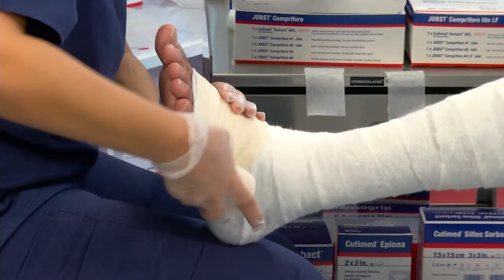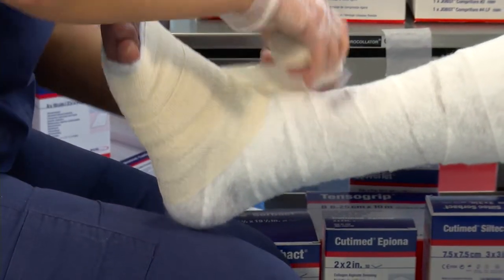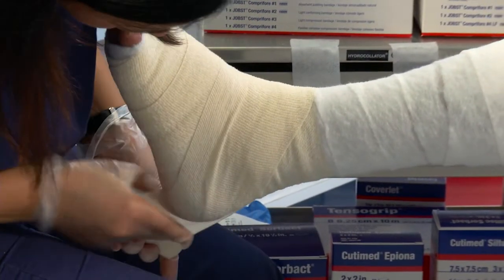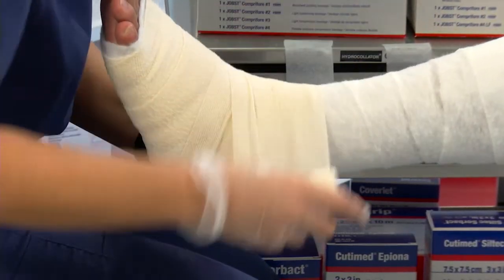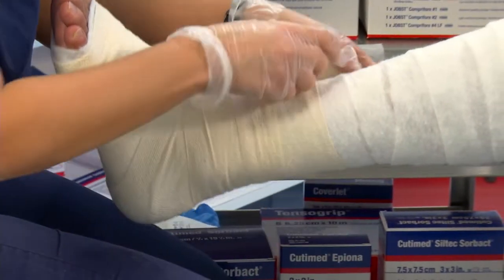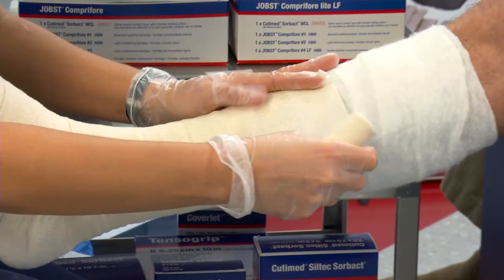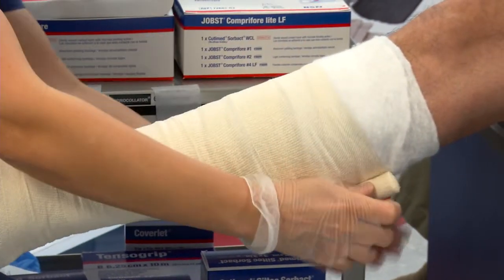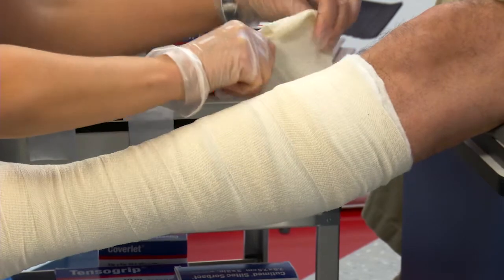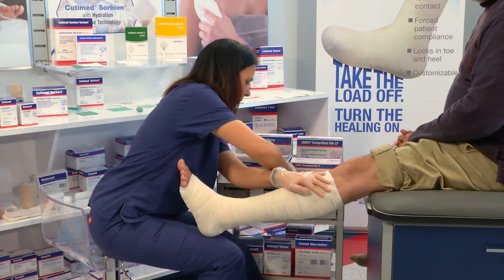We're going to apply it in the same fashion as layer number one. We're going to anchor it around the base of the toes. When we come to the ankle, we're going to do a figure of eight and come back and capture the heel. Then we're going to spiral up the leg in a 50% overlap. I have my tape ready to secure it in place.